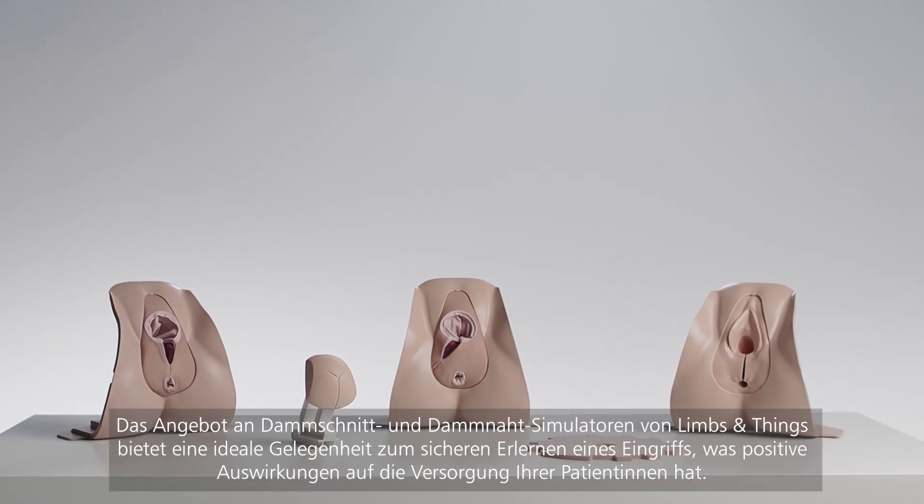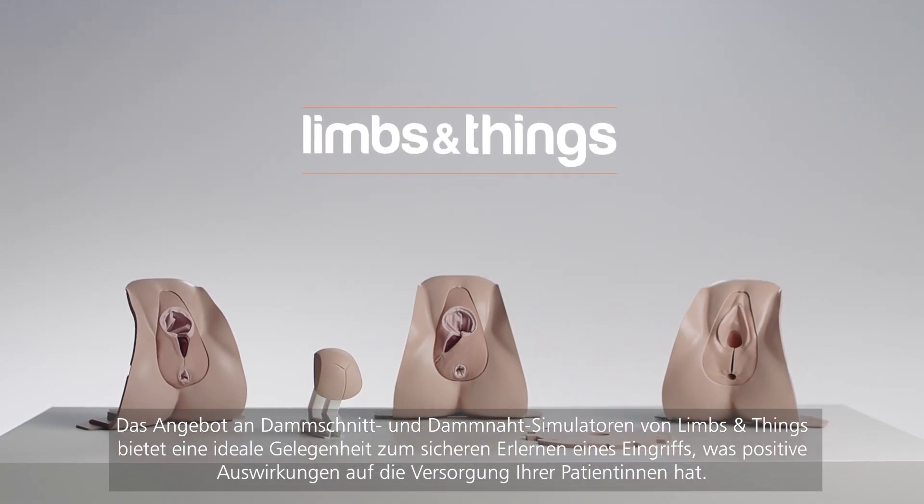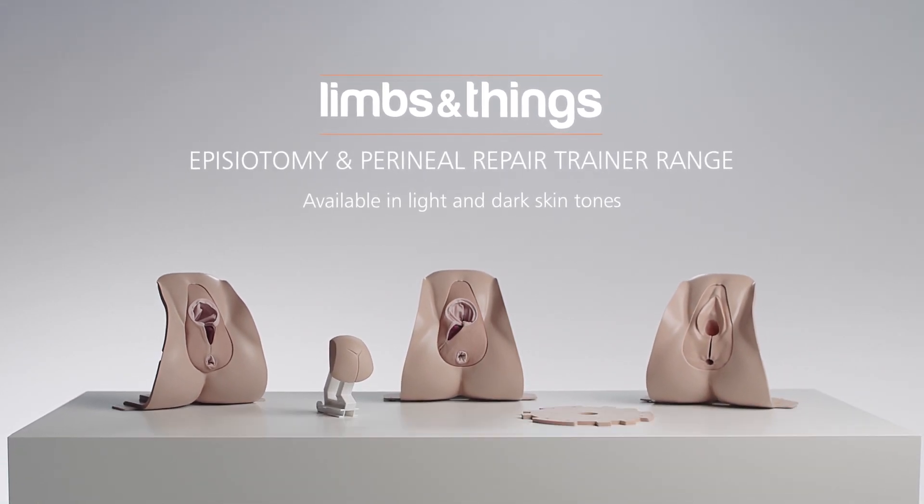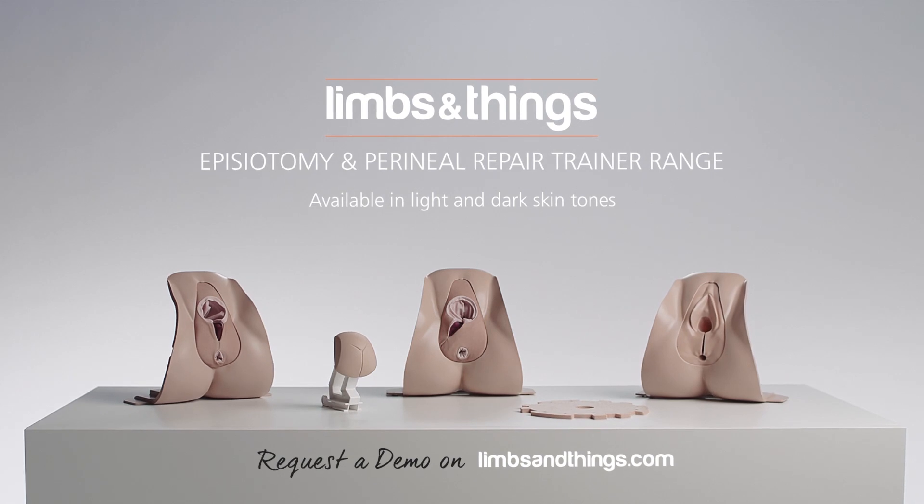The episiotomy and perineal repair range from Limbs and Things is ideal for gaining confidence and procedure mastery, leading to improved patient outcomes.